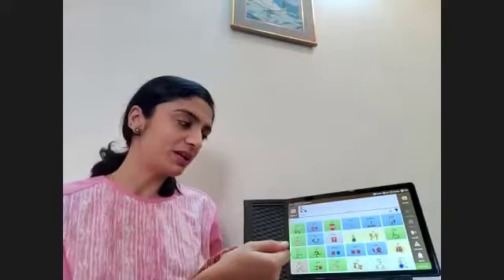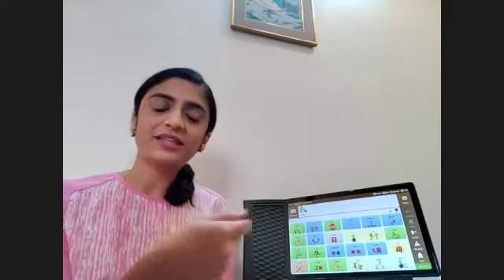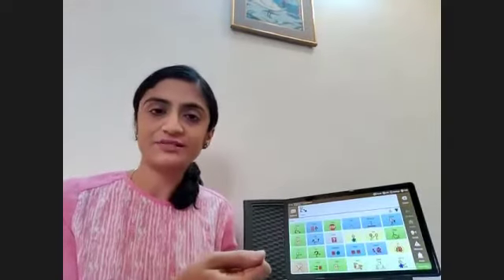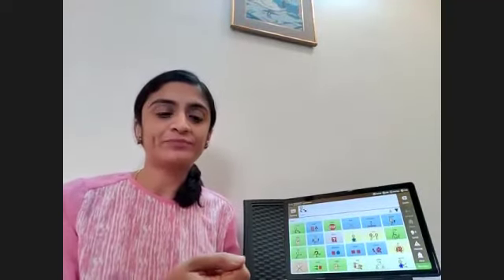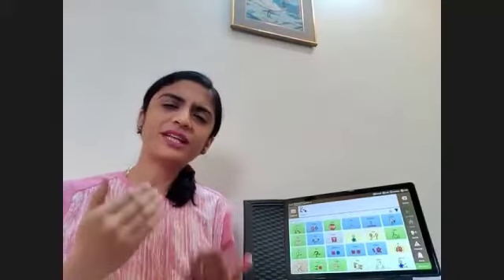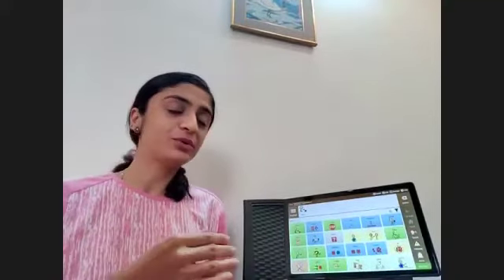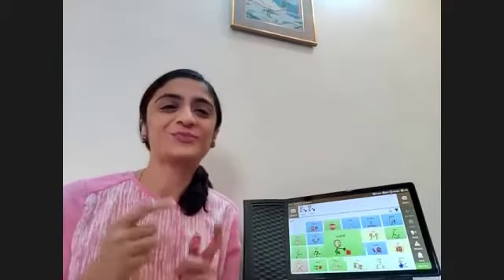So the next step would be to give the device to them and then give them an opportunity to say it themselves. So at this point, you have to remember that you don't need to force them to respond because you've shown it to them and they've already got that input. So if they don't respond, that's okay. You can just answer for them. You can say, oh, so you want to read the storybook? Let's go. Let's do that.